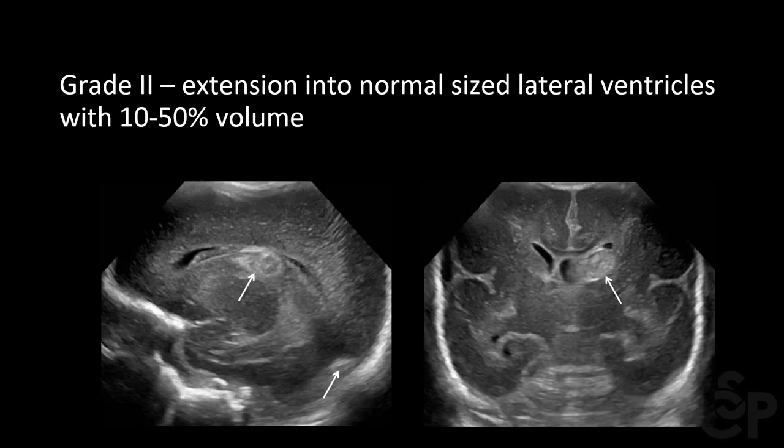Grade 2 is defined as hemorrhage with extension into normal-sized lateral ventricles, occupying 10 to 50% of the ventricular volume. The sagittal view on the left shows — as indicated by the white arrow at the bottom — that the hemorrhage is also layering in the occipital horn.